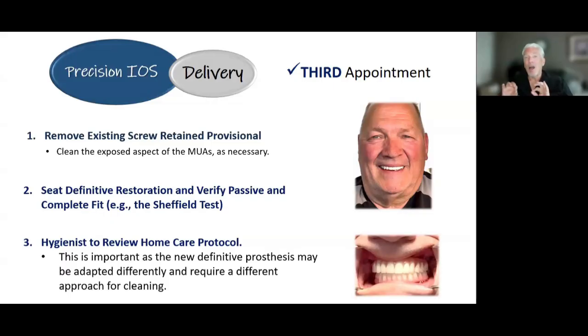So you're probably going to have to have your hygienists retrain or reteach them, so to speak, and maybe they have to modify their home care protocol. Maybe they need something different to be able to get something in there to clean underneath this prosthesis.